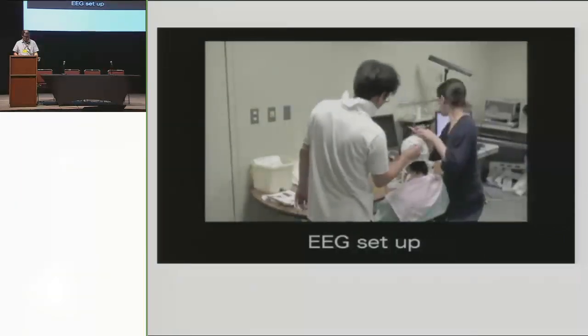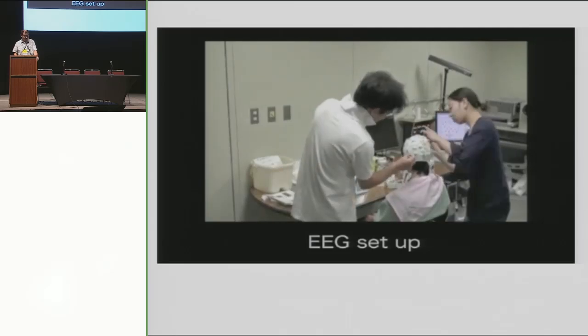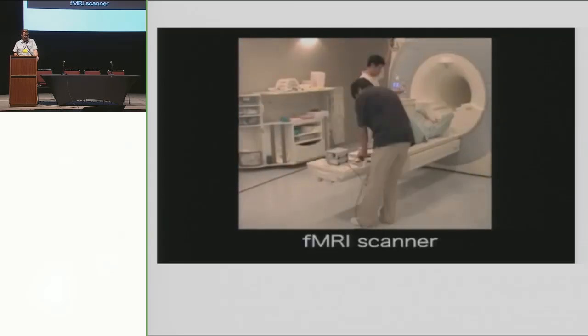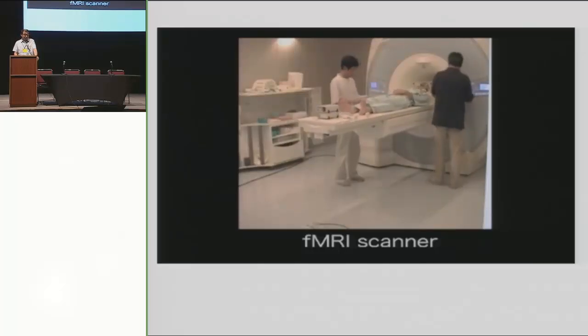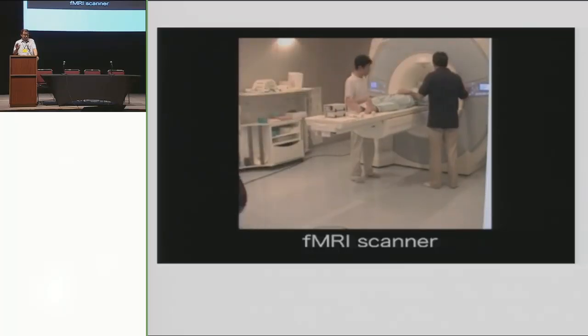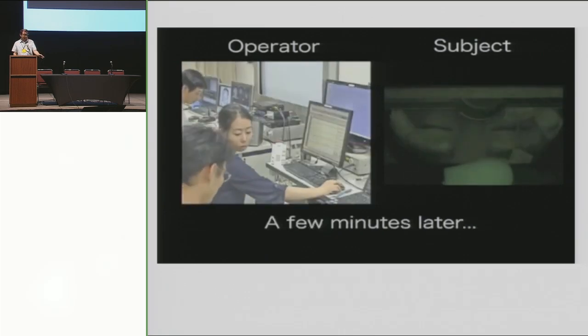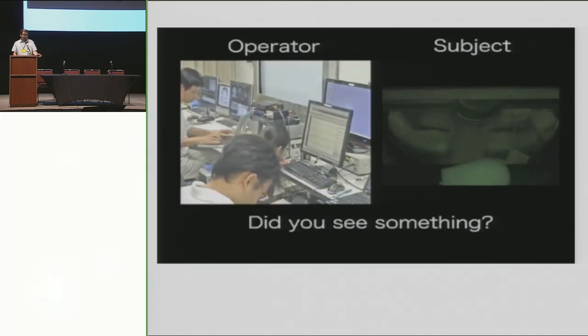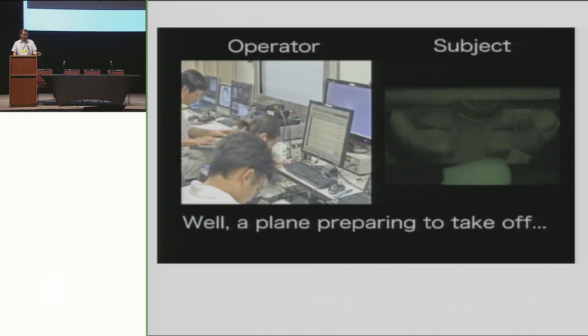Actually, this is the subject wearing an EEG cap. So we do simultaneous EEG and fMRI measurement, and from EEG we monitor sleep stage. And this woman, Dr. Tamaki, is a trained sleep researcher and EEG reader. She's now monitoring the EEG and determining when to awaken the subject.